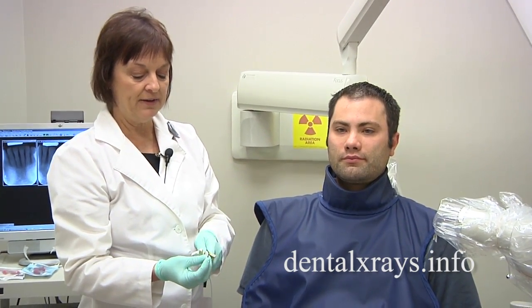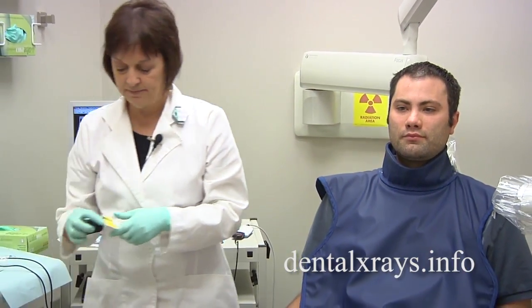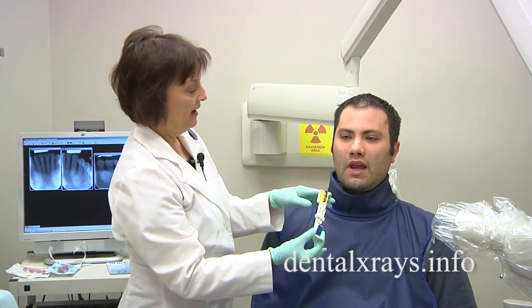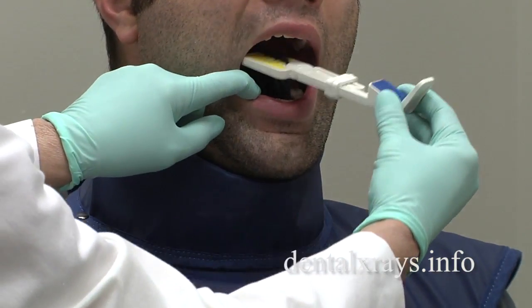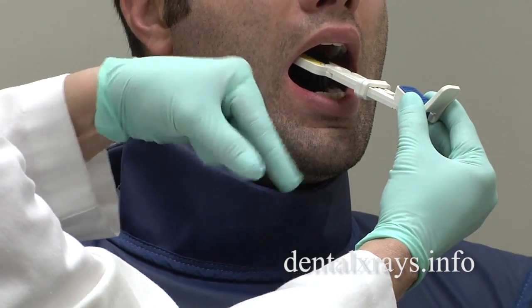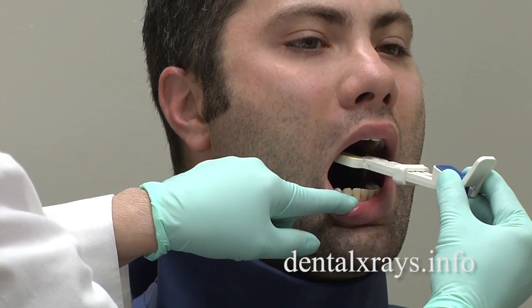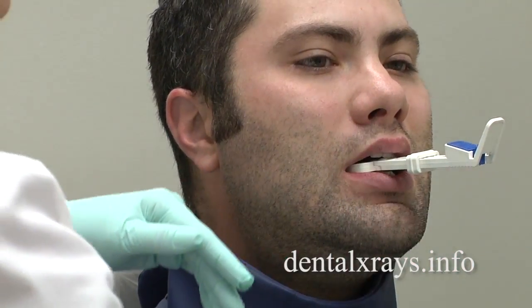Sometimes the premolar PAs also create a problem when there are tori in the mouth. I'm going to show you two techniques — first the bisecting angle. Again, what you want to do is put the film itself not on top of the tori, so that the film is next to the teeth. Move it away so that the film sits directly between the two tori. There should be a space between the two that allows you to lower the x-ray film in — right in between the two. Have the patient gently close, and as they close the film is going to adjust accordingly to how it can fit.